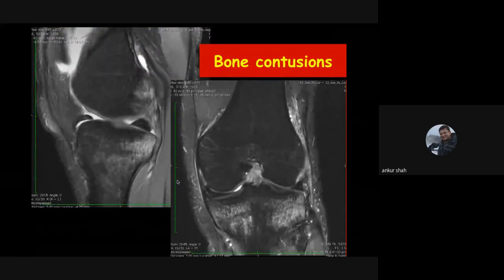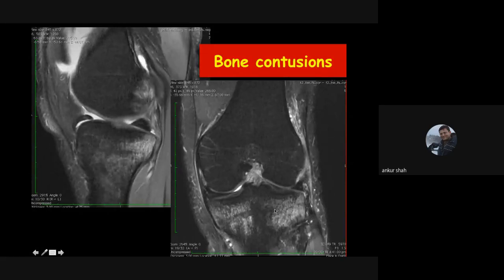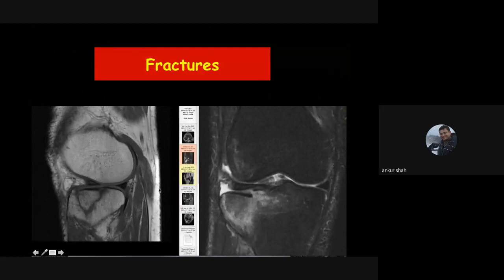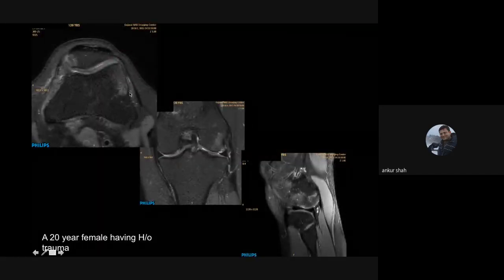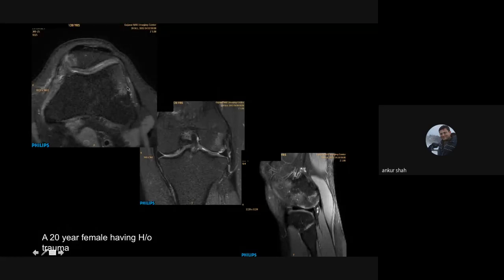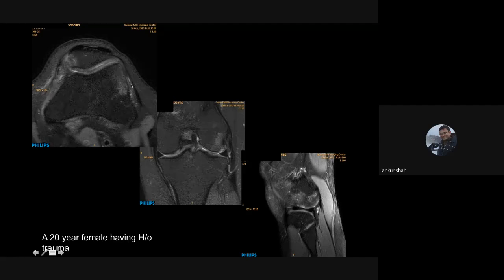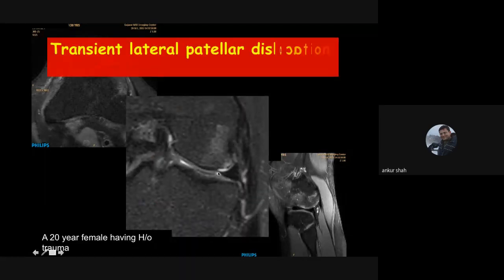Bone contusions are very well seen on MRI — a patient with multiple bone contusions may have a completely normal radiograph and CT scan, but contusions can be severely painful. MRI can detect these contusions before they progress to fracture. Specific patterns of bone contusion act as a footprint of soft tissue injury: contusion at the anterolateral aspect of the lateral femoral condyle and inferomedial aspect of the patella is the classical appearance of transient lateral patella dislocation, usually associated with medial patellofemoral ligament or medial patella retinaculum injury, and can be associated with focal cartilage injury.